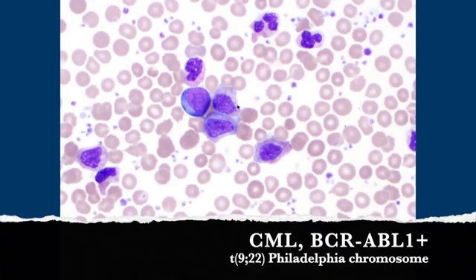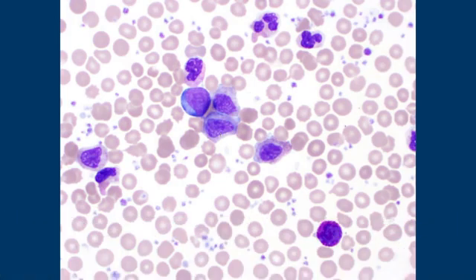And these myelocytes, can they look a little bit like monocytes? If you look really closely, these are young myelocytes because they've got that blue tinge still. They're getting their secondary granules. So they've transitioned from the promyelocyte stage where they only had primary granules, and now they're getting their secondary granules. This is a little bit of an older myelocyte, and you can see the cytoplasm is pinker and looks more like the neutrophil. They're still myelocytes.